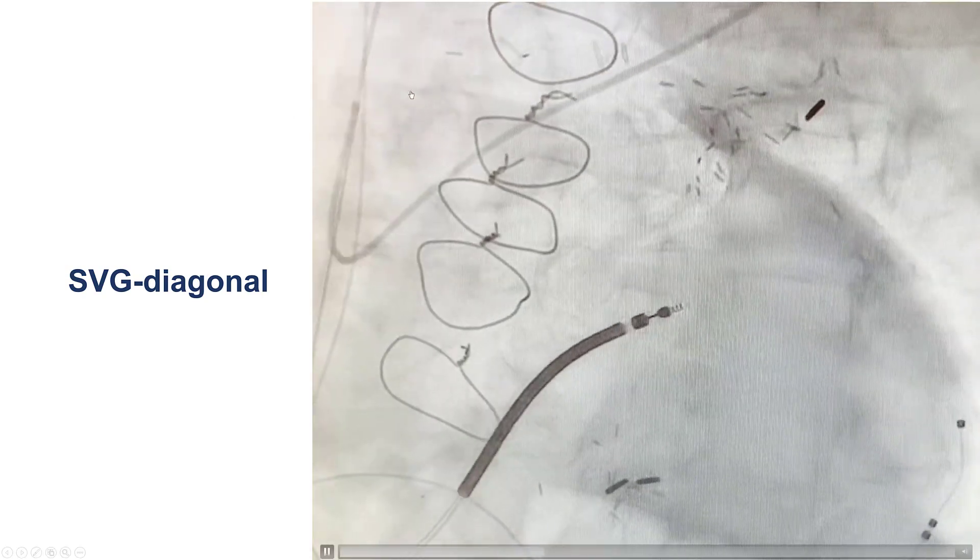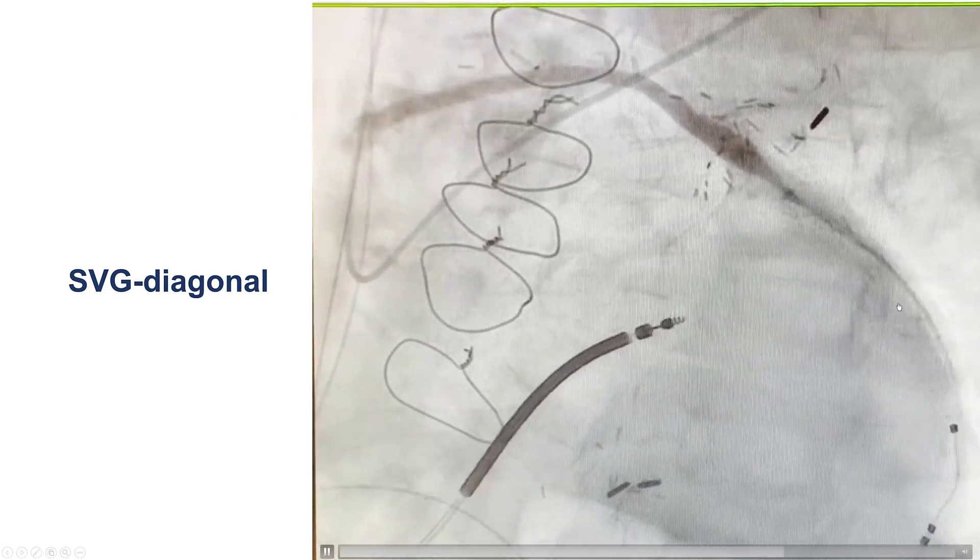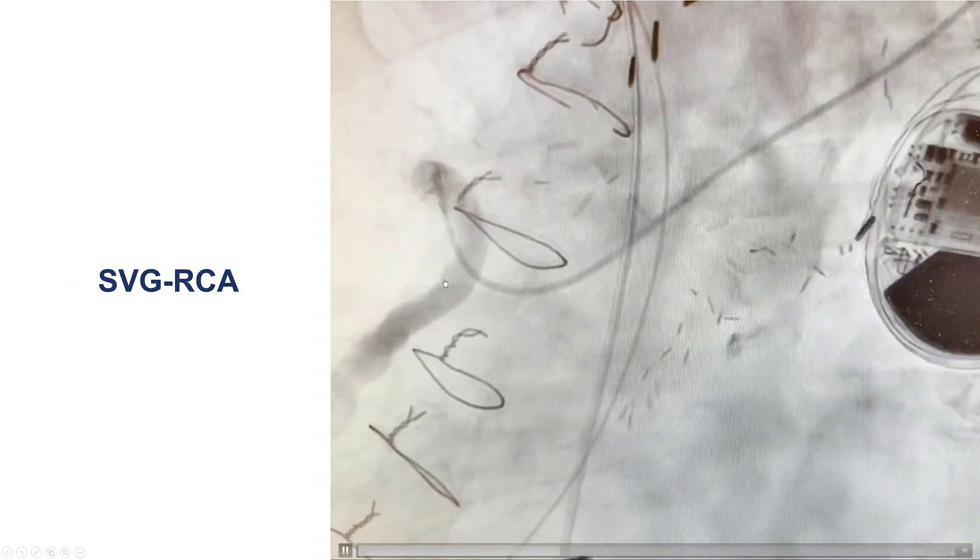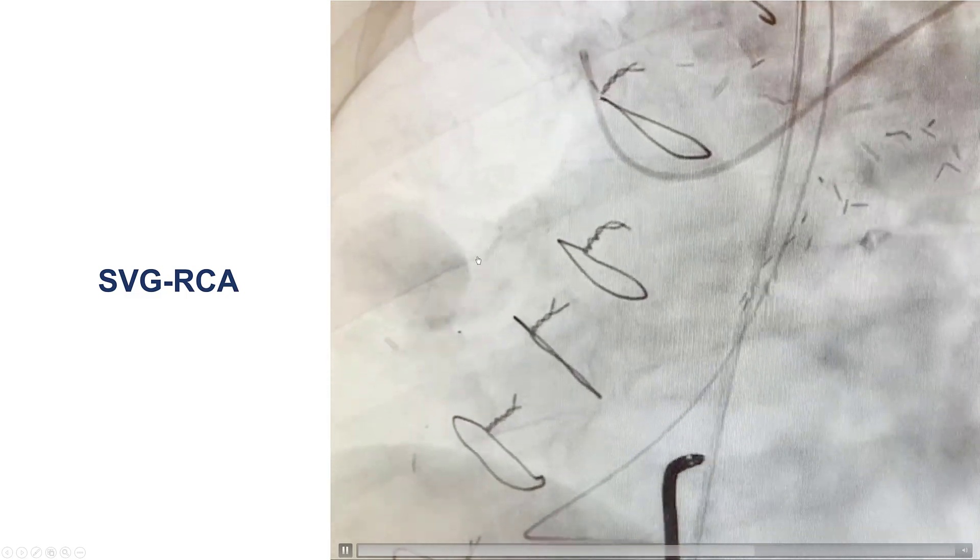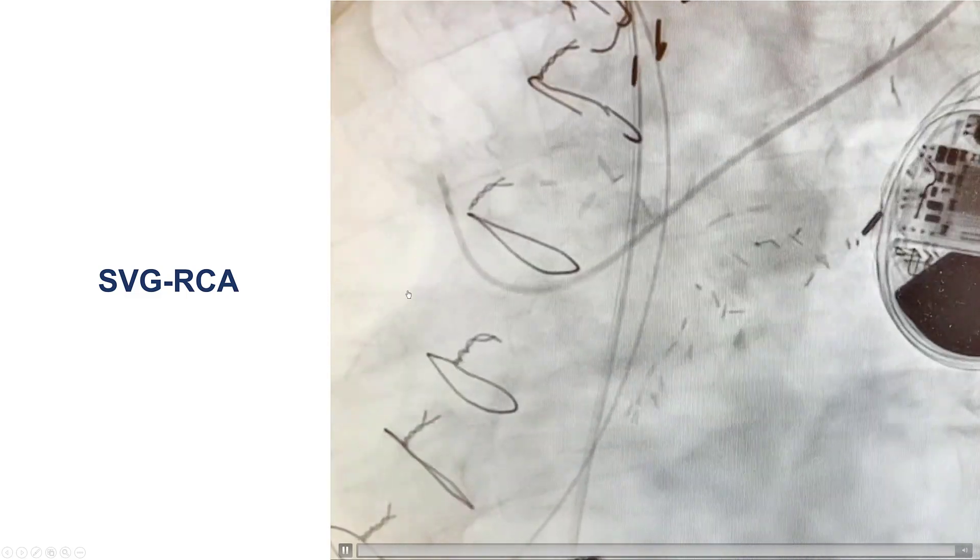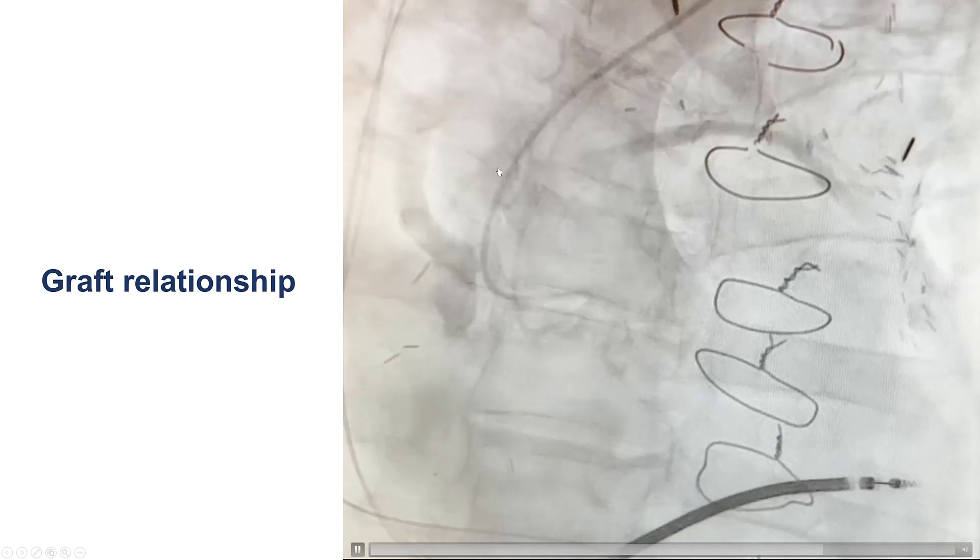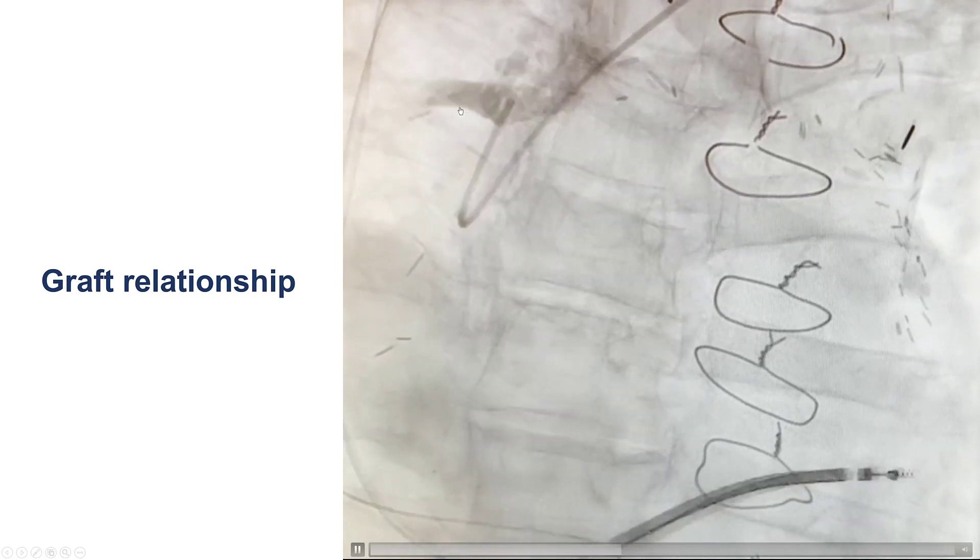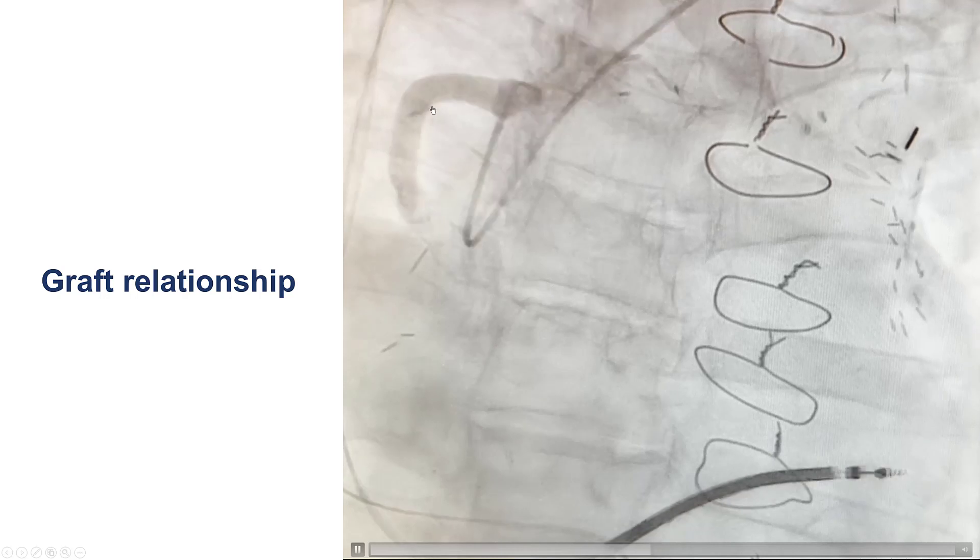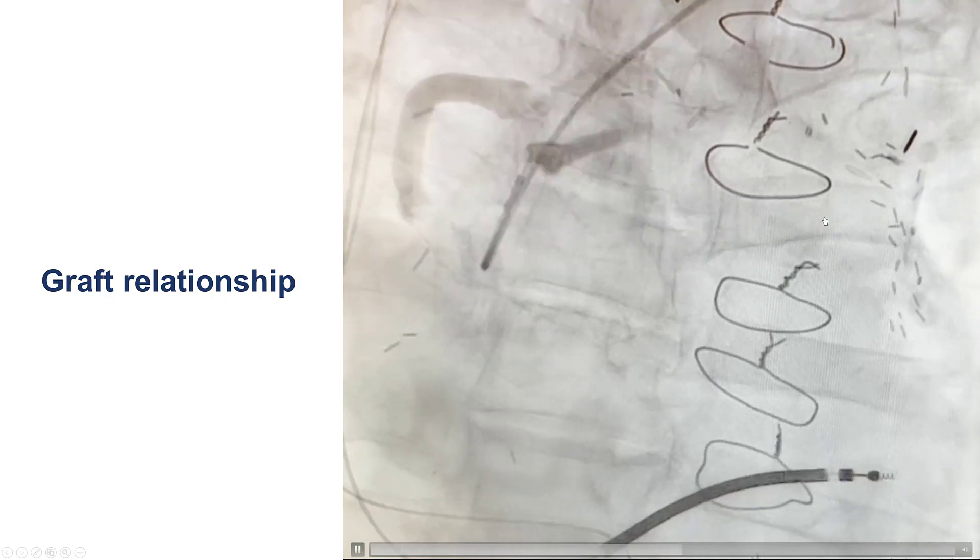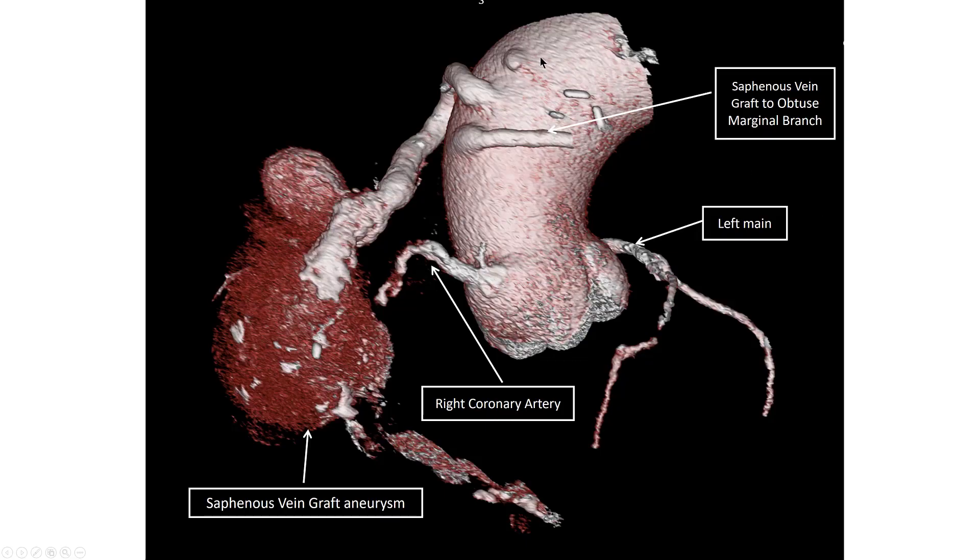The patient had a vein graft to the diagonal branch that was patent with good flow, and the vein graft to the right coronary artery was poorly visualized because contrast was entering into this large cavity of the aneurysm. This is a simultaneous injection showing the spatial relationship of the vein graft to the right coronary artery that is aneurysmal, as well as the vein graft going to the diagonal branch. And this is a coronary CTA demonstrating the saphenous vein graft aneurysm.